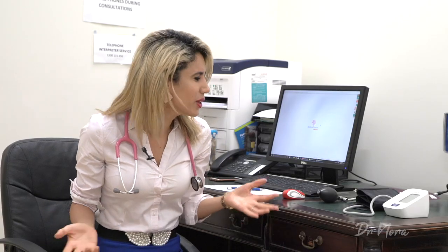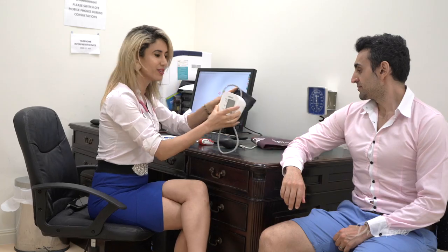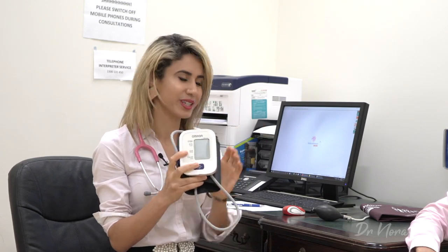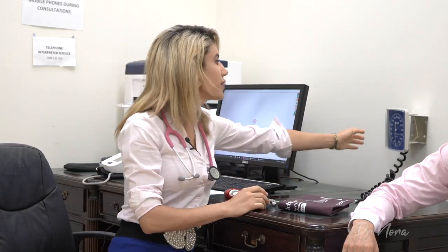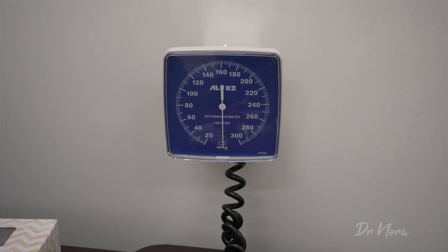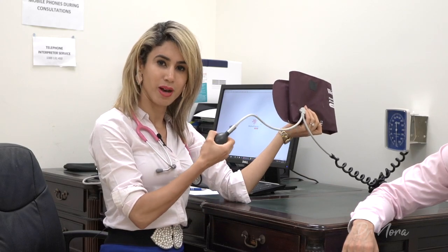How do we even do the blood pressure? How do I use this pumping-up machine? Well, for this part I'm going to need a model. So we're going to be using today the aneroid meter. As you can see, there is a dial that is usually attached to a wall, connected to a cuff, and it has a pump that you can pump like so.